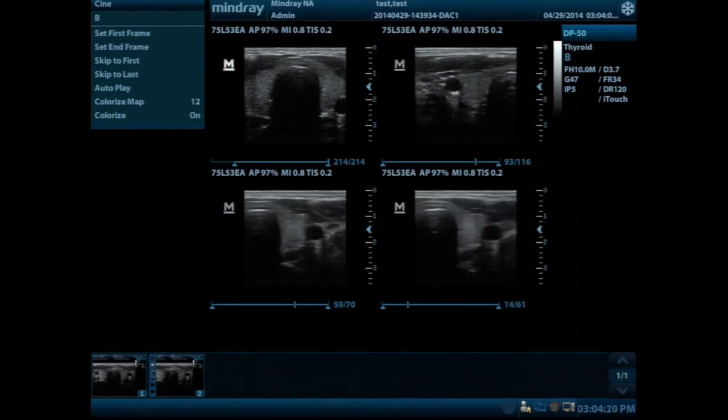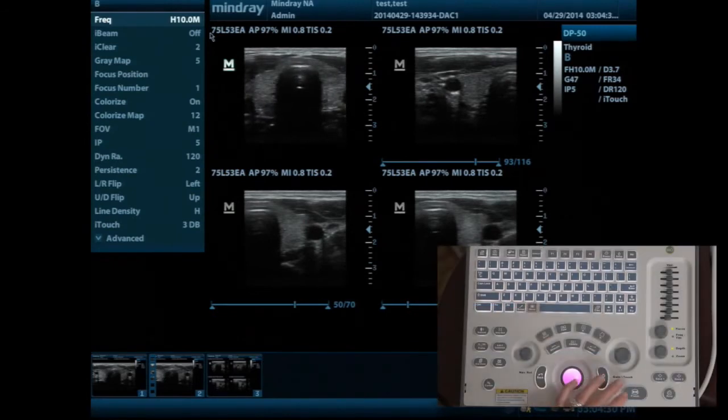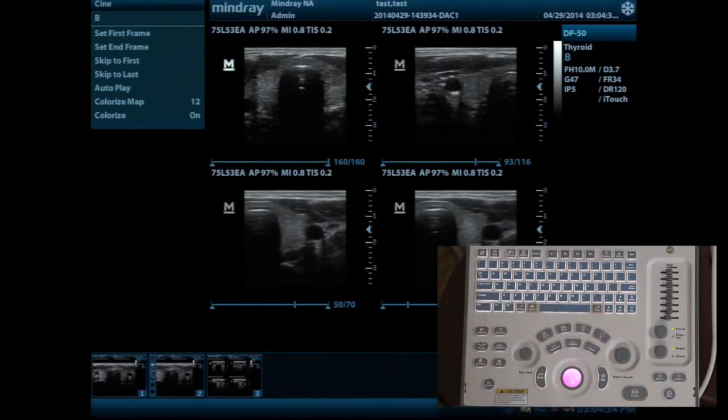Nice. And when you freeze again, you'll go out. I could take that if I wanted to. You could, absolutely, yep. So you hit save 1, which again saves the still image. If you wanted to print that, if your machine came with a printer, the print button would be just below. And then, I always recommend saving the image prior to hitting print, and that way you have it saved to the machine as well as your little printout if, again, you chose to have a printer.